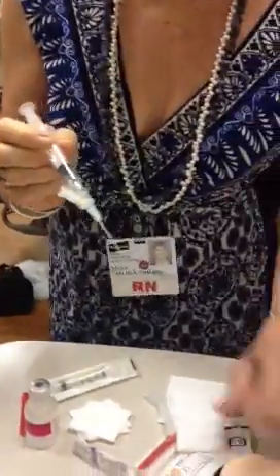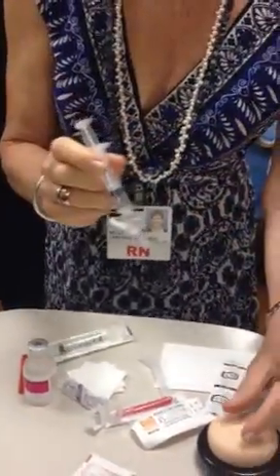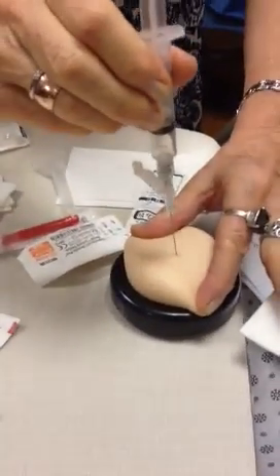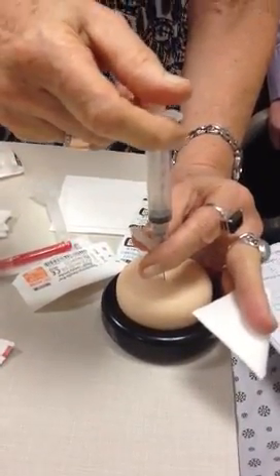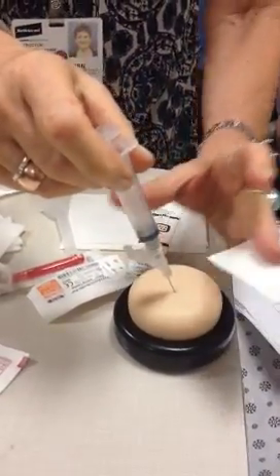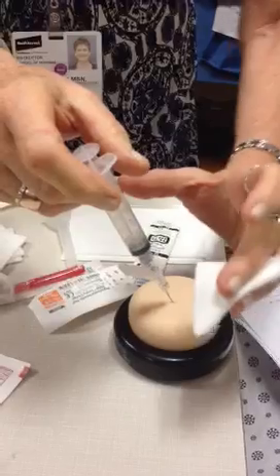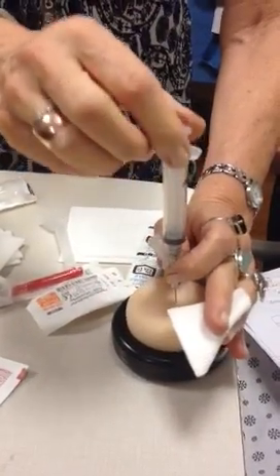Okay, let me just show you one other thing you can do. So you spread, right? You have your cotton here, your little swab. You spread. Do it like this, and then you hold it while you're giving it. So if you're shaking or anything, it's not going to be transmitted to the patient. That's why she was doing that. You have your hands on the patient like this, and as soon as you push it in, you hold it.